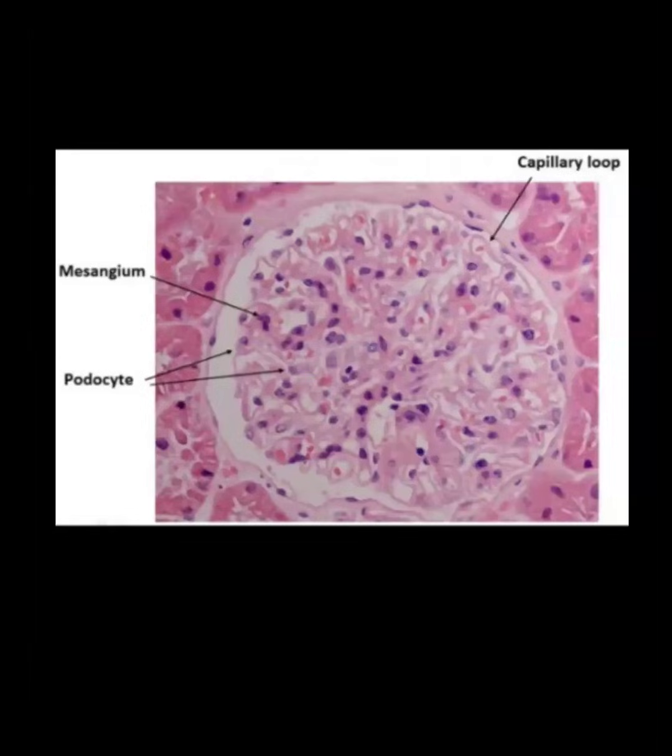Mesangium, the space between two capillaries. It contains a tuft of capillaries, and the space between the two capillaries is actually mesangium.